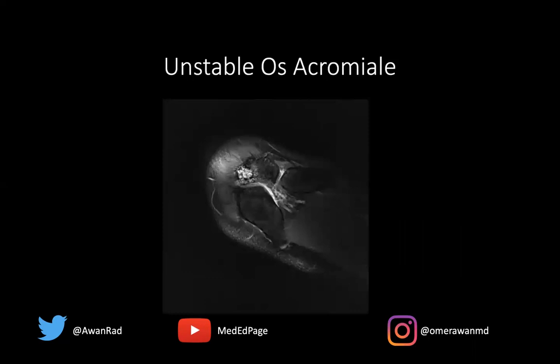What do we look for to identify an unstable os acromiali? This is an axial T2 fat-sat image through the shoulder at a superior slice. This is the clavicle and this is the acromion — the acromion is broken into two different bones with a cleft. This articulation is known as a synchondrosis between the os acromiali. Notice there is cystic change, marrow edema, and fluid at the synchondrosis, which suggests mobility and instability. So we can say this os acromiali is unstable.